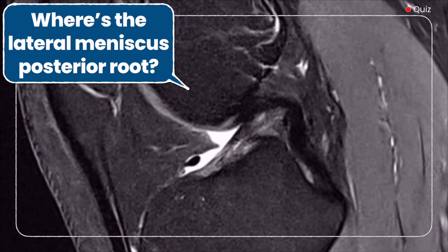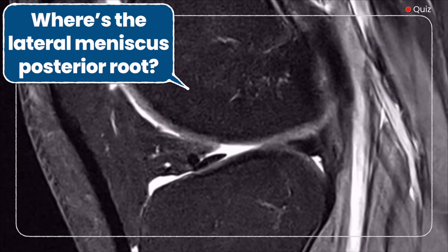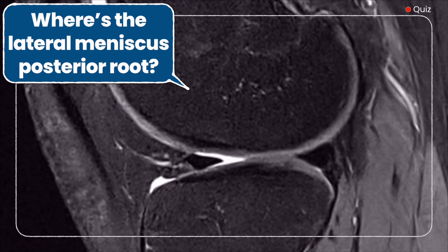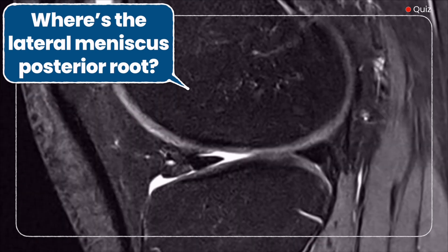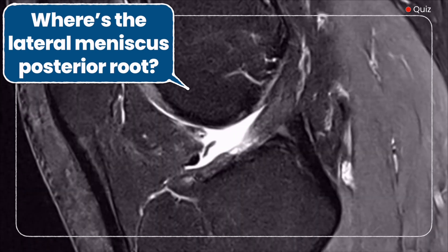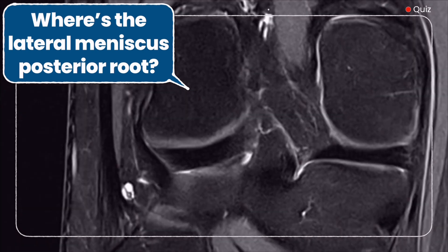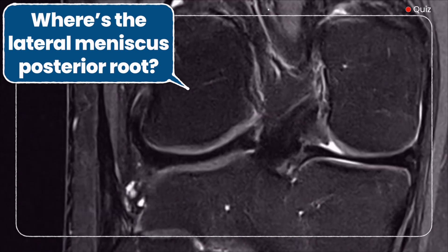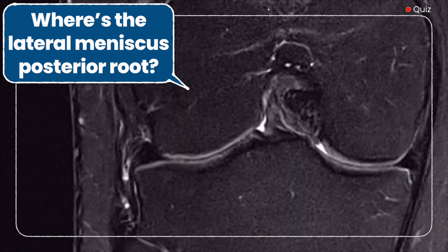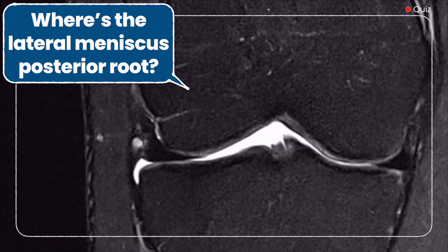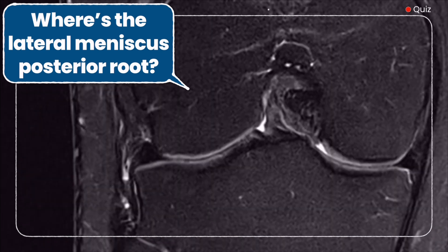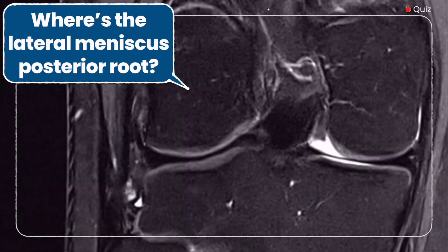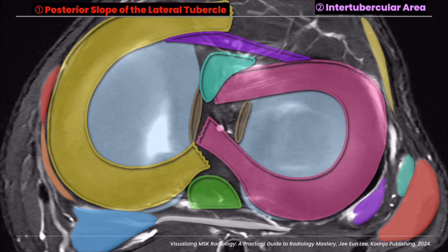Let's take a look at a normal sagittal image of the knee. Try to locate the posterior root of the lateral meniscus here. Understanding the normal anatomy is the foundation for recognizing pathology. Knowing the insertion sites is crucial.